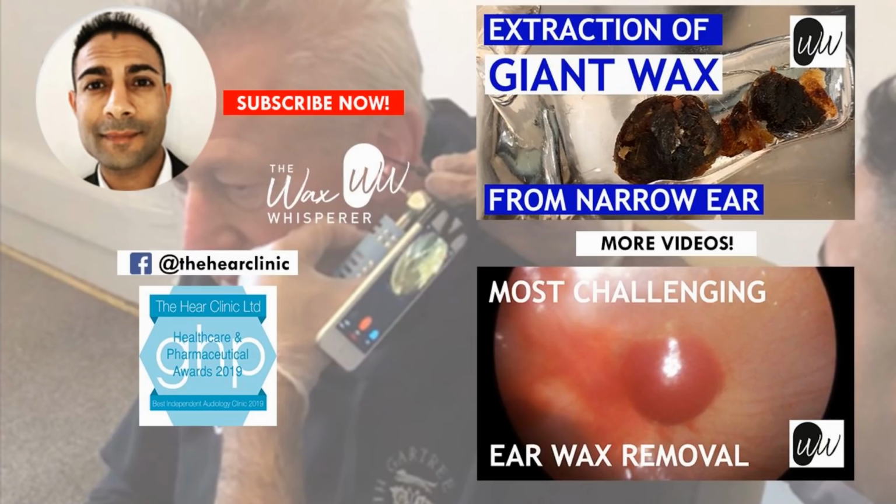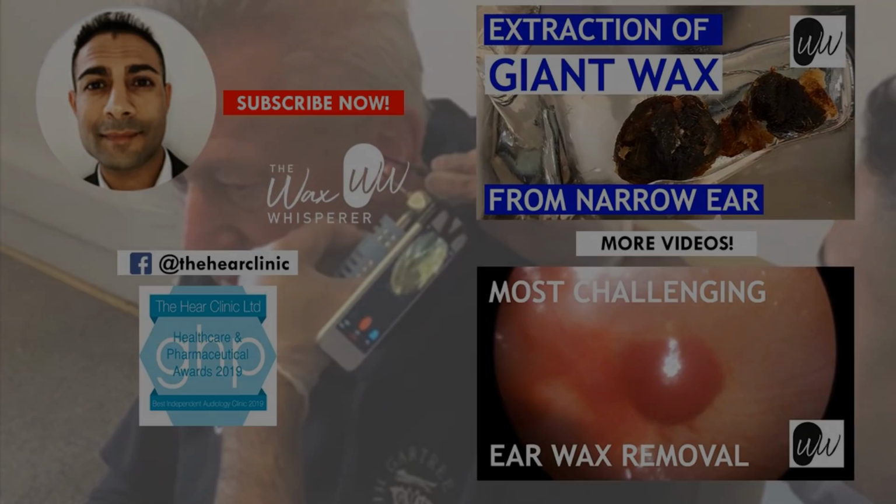We got as much dead skin out of the ear as we possibly could in a safe and comfortable manner for the patient. We referred the patient back to the GP. In the meantime, I provided some over-the-counter treatments for the otitis externa and the patient's glue ear.